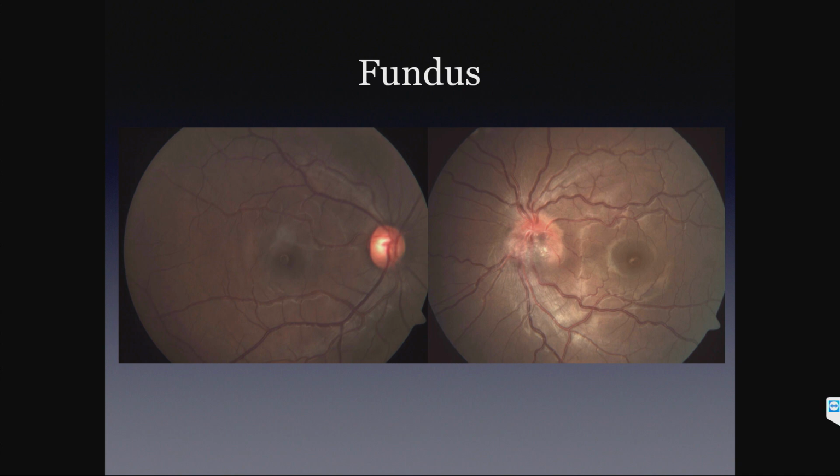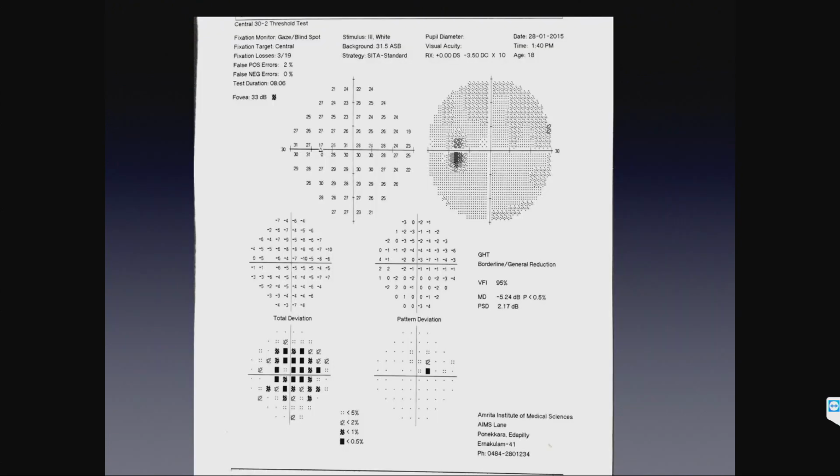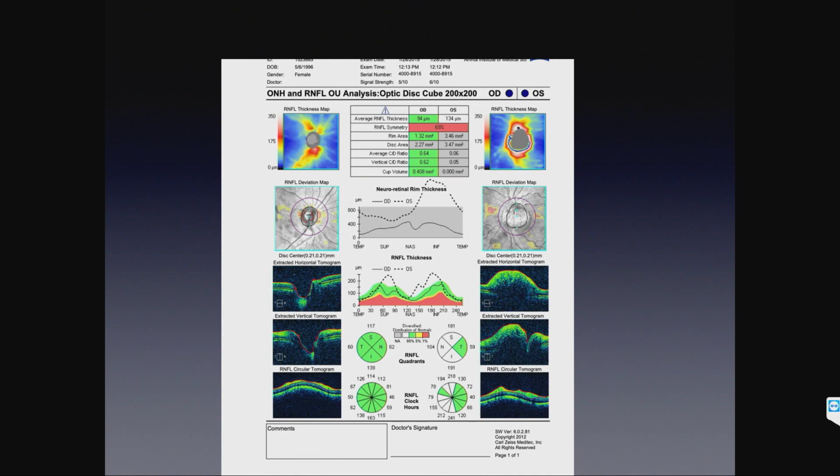The left eye, again there was an inferior lesion which was elevated, obscuring the margins with fluffy borders with hyperpigmentation on the surface, which is very much suggestive of optic disc melanocytoma with the vessels appearing tortuous. The fields showed a small paracentral scotoma, and the disc showed swelling of the peripapillary RNFL, which was due to the lesion itself. So this is a benign case of melanocytoma, and we decided to observe the patient. She was advised yearly follow-up.